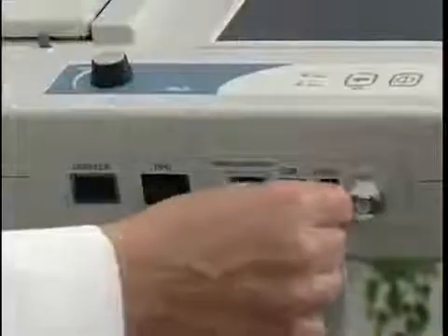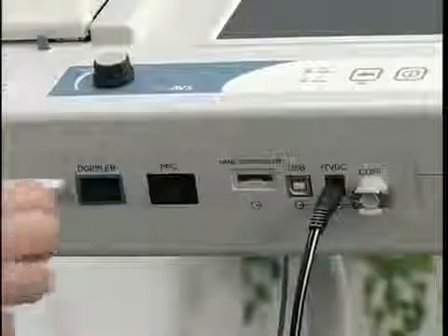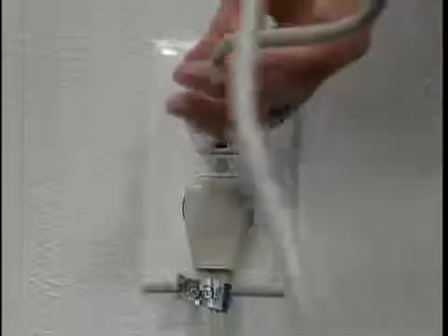Plug the external power supply into the power connector labeled plus 7VDC. Plug the Doppler cable into the Doppler connector, the blue port. Plug the PPG probe into the PPG connector, the black port. Plug the power cord into a properly grounded wall outlet.